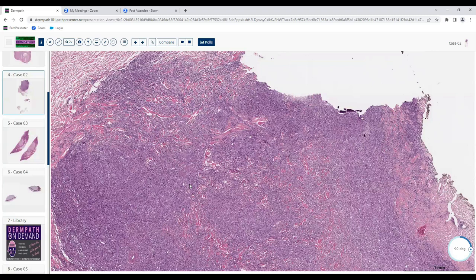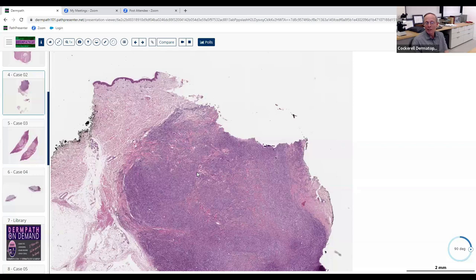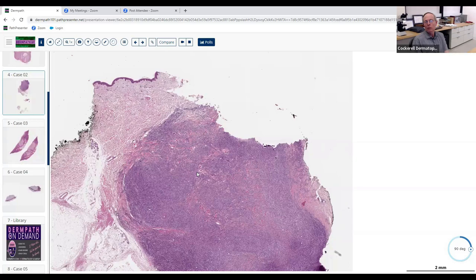Lymphomatoid papulosis — that's the most common one. Not every form of LyP is CD30-positive, but the vast majority are, and they typically present with multiple small papules rather than a large tumor like we have here. So this would be more consistent with primary cutaneous large cell anaplastic lymphoma, CD30-positive. Is there another stain you can do to tell you whether this likely has good or bad prognosis?